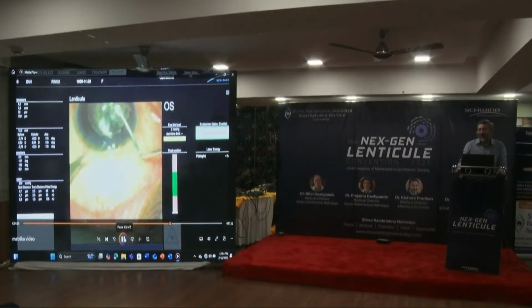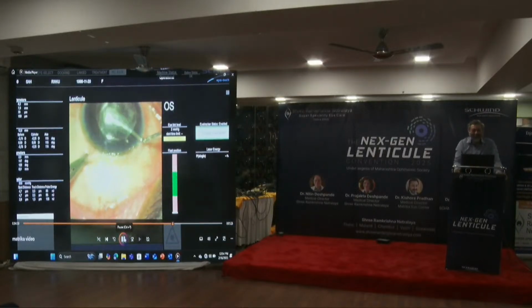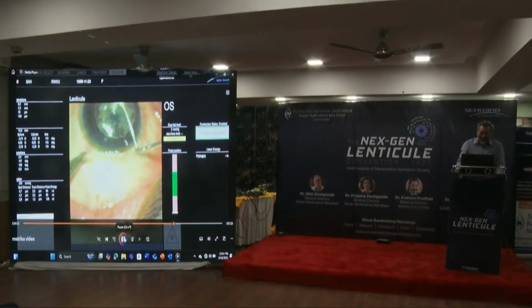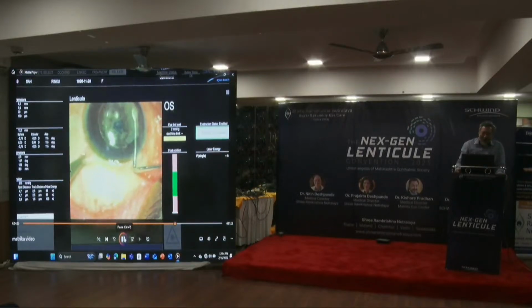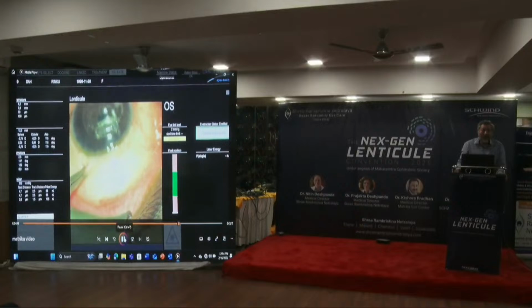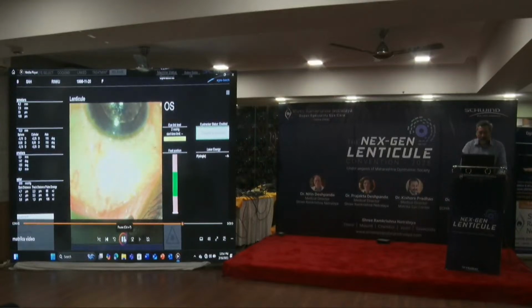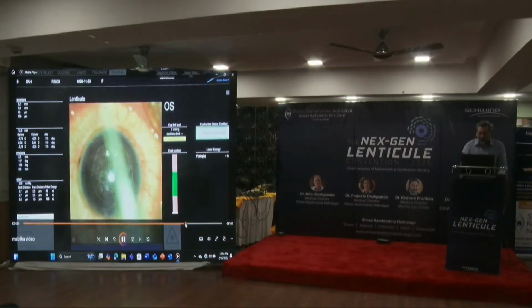I really love scaring my patients. So what I have is a small tear in the cap over here. Even after whatever number of surgeries, we don't play God. We are doctors, you know. So see, I have a small cap tear at the edge over here, like mayonnaise. So the surgery is done.